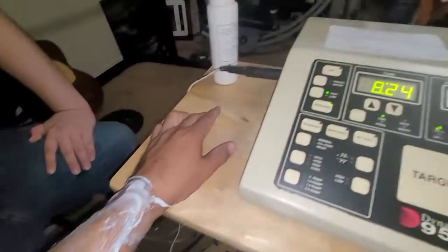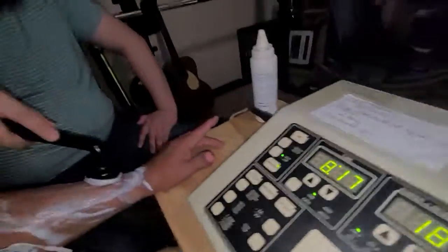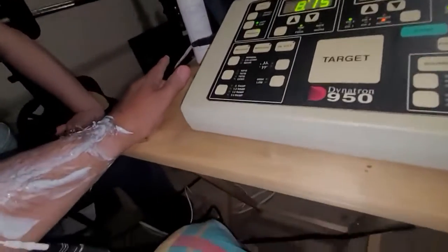And then, of course, don't forget to turn off the power button in the back. Good to stop. Yeah, go ahead and stop.